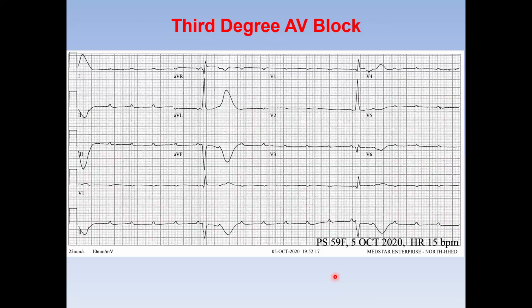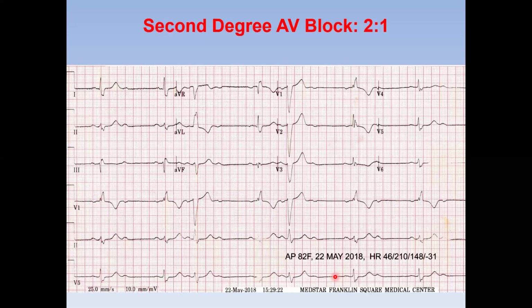This patient, of course, sir, should undergo pacemaker, I think. Yes, alternating bundle block, no question. If this patient comes with syncope to the hospital, and I'm not doing a pacemaker the same day, I would probably put a temporary pacemaker in, because these are the patients that are more prone to develop intermittent high-grade AV block and asystole.